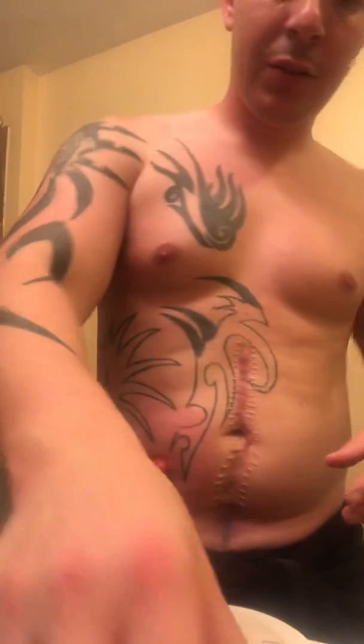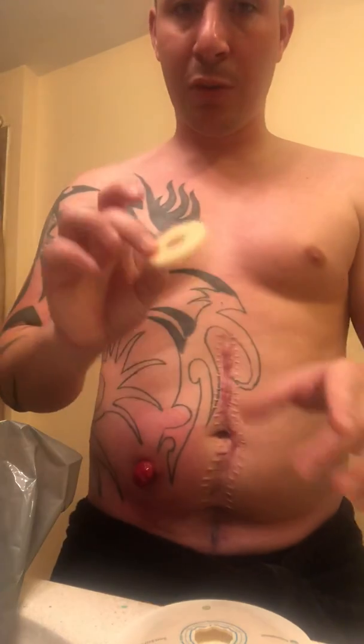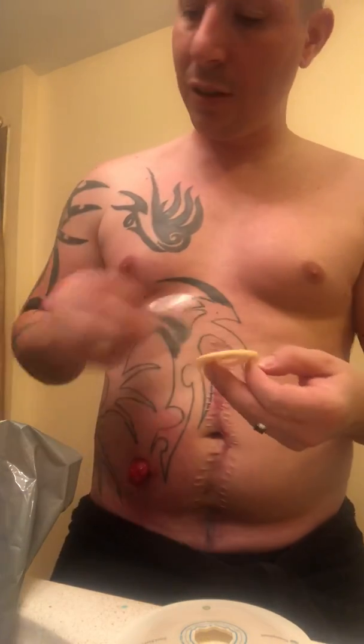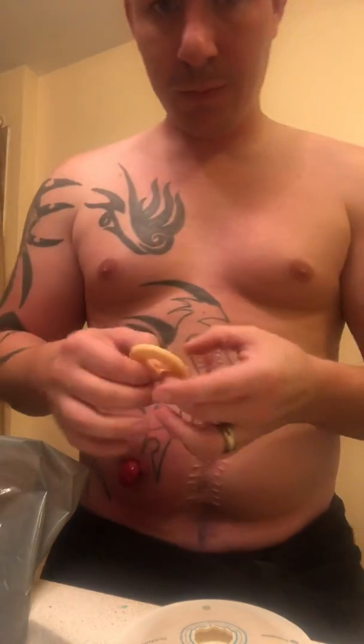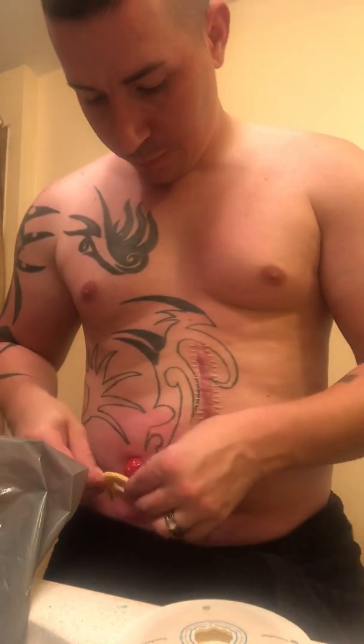All right. And now we're gonna take our E-Conceal, and it's moldable, so we take it and you're gonna adjust it to the sides of your stoma. There we go, nice tight fit.